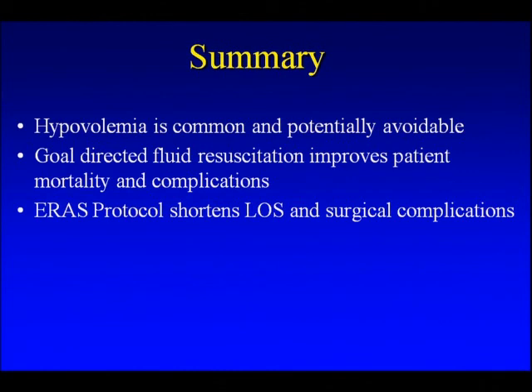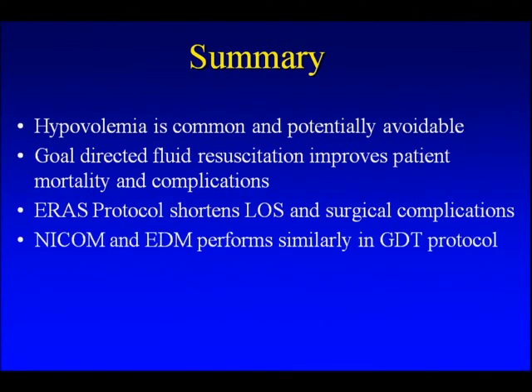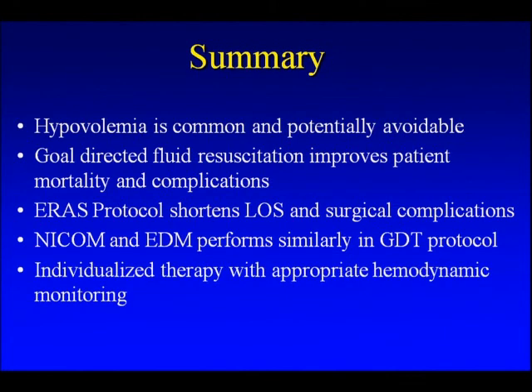I think there's going to be much more protocolized care because many studies have shown that using the strategy of enhanced recovery after surgery can in fact improve patient outcome, reduce complications, and therefore achieve an earlier discharge for patients. And in the study that I just showed you, the NICOM device and the esophageal Doppler performed similarly well in the goal-directed therapy protocol.